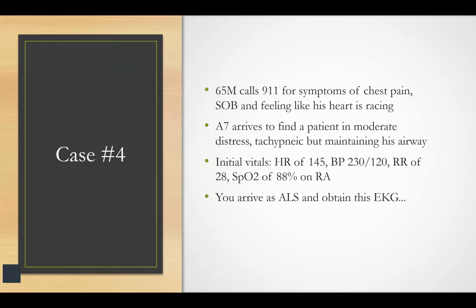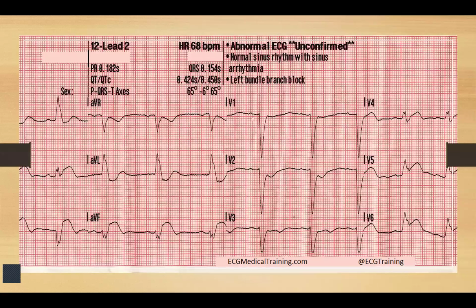But his heart rate's kind of going up and down. And then you get this, and you ask the patient, sir, has anyone ever told you you have a left bundle? And the patient says, why, yes, Benny, I have been told that I have a left bundle.